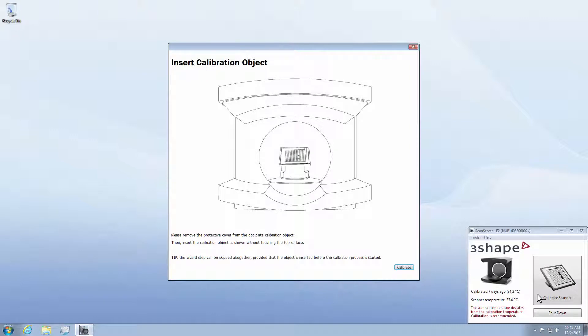Following the instructions on the screen, you will be asked to prepare the calibration object and remove the protective cover from it. Be careful not to touch or attempt to clean the dotted surface of the object, since that will result in faults during calibration.